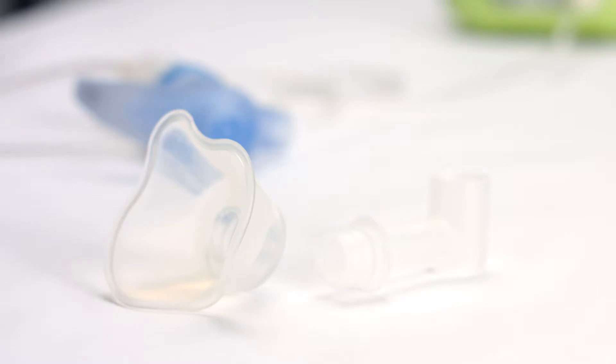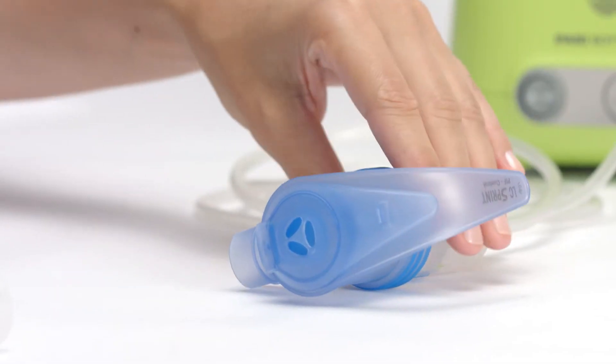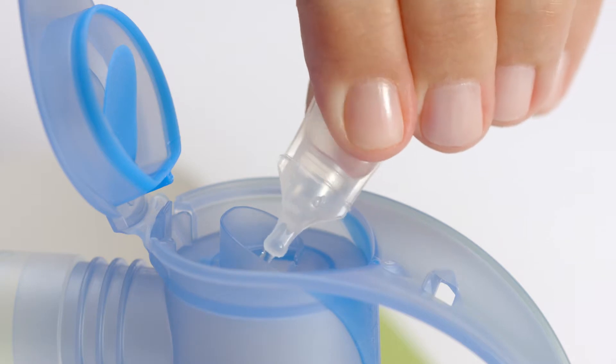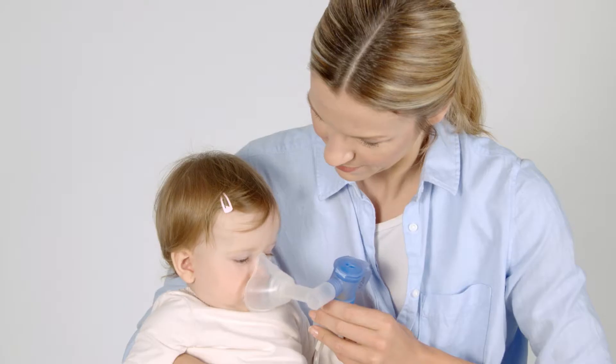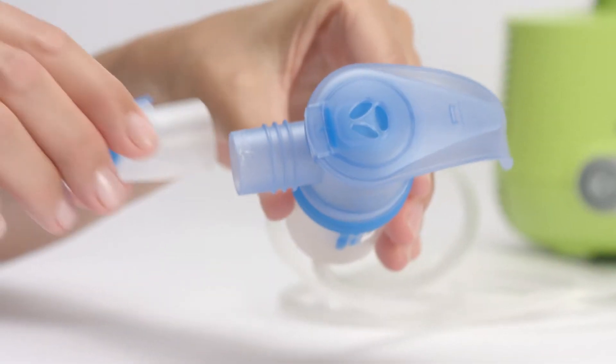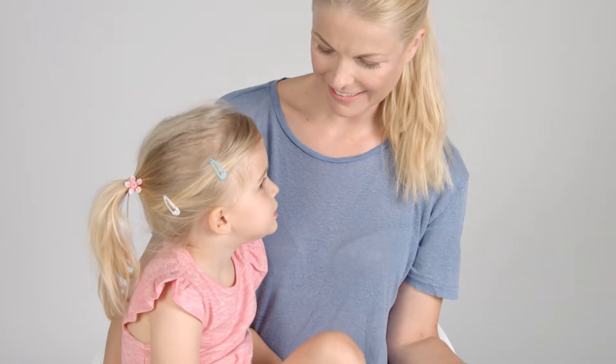Attach the baby Bend and baby mask, or the mouthpiece, then pour in the inhalation solution. Position the Bend and mask in accordance with the child's position. If using the mouthpiece, sit upright in a relaxed position with your child.